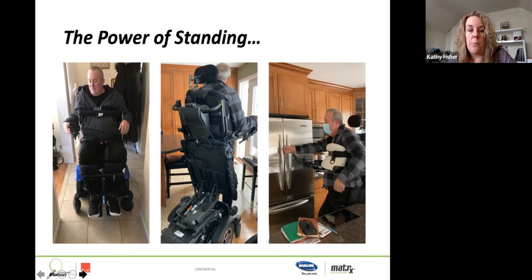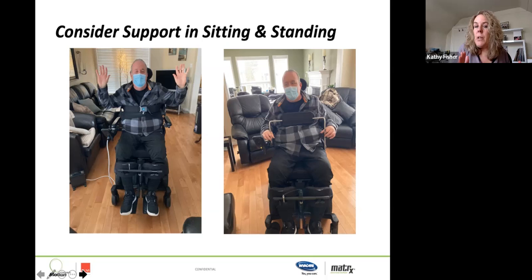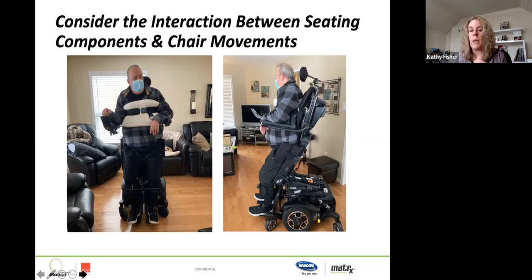And if we look at him, I'm just trying to get to the next slide here. If you look at what's happened, I see him drifting left laterally a little bit. So I would like that belt to give him a little more support. And I want to look at this kyphosis that he seems to have developed. You can see it when he's up and standing. So we're going to make some changes to this. Like I say, he's kind of a work in progress. But the main thing is he's been able to change his position because he's always looking forward. He's looking down at his computer. He's looking down at the TV. So he's gotten himself in a routine where he stands for 45 minutes every night. And he wouldn't have been able to do that without this.